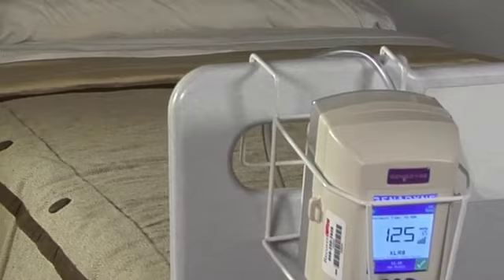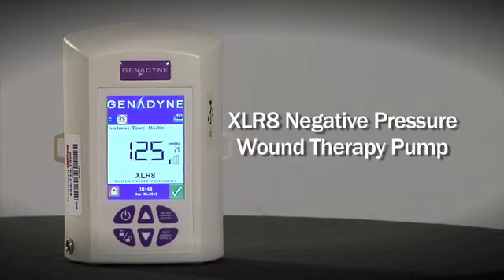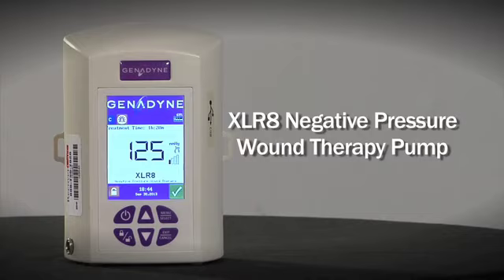The Accelerate Negative Pressure Pump provides effective negative pressure therapy for both bedside and ambulatory applications when negative pressure therapy is chosen to speed wound healing for your patient. Genodyne provides 24-hour, 7-day-a-week clinical support.